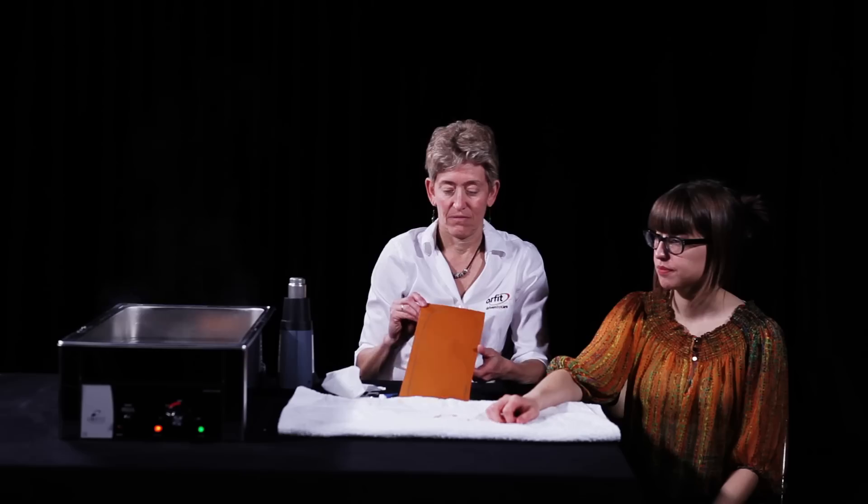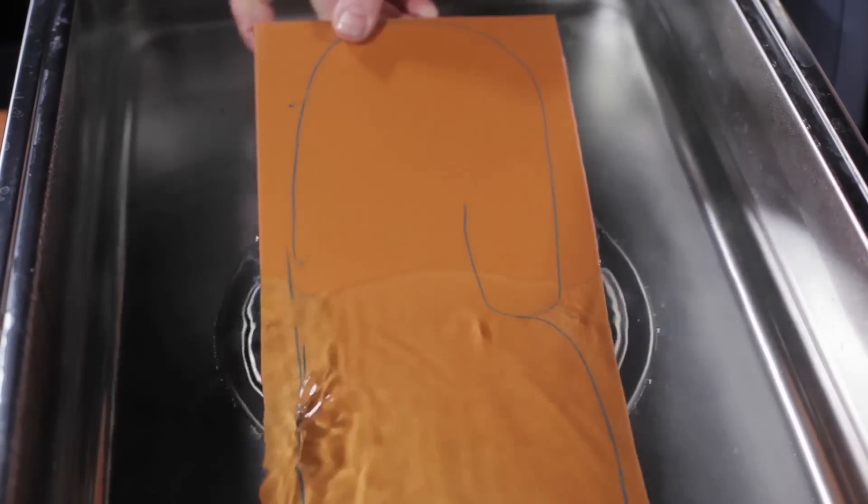Draw the patient's hand on a paper towel and make a pattern of the orthosis, which is then traced onto the thermoplastic material.